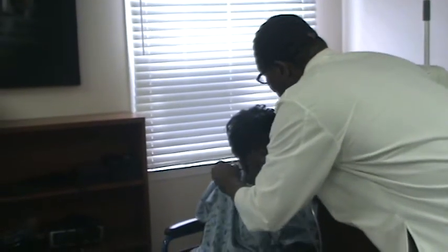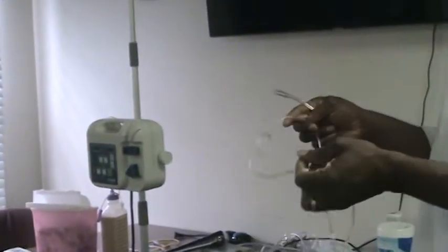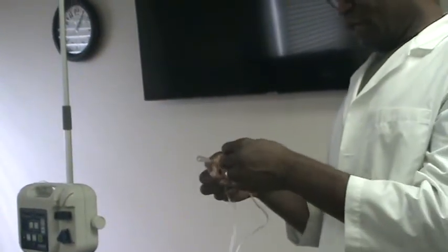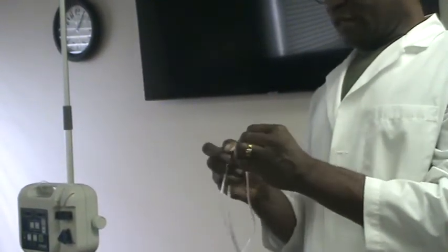But her ear is not going to hold, so it will be like that, and then you're going to adjust it. This goes to the cylinder. You can adjust it to fit, but you have to be checking it frequently to make sure that it's still on and the oxygen is still flowing.